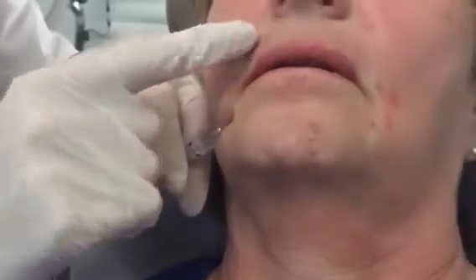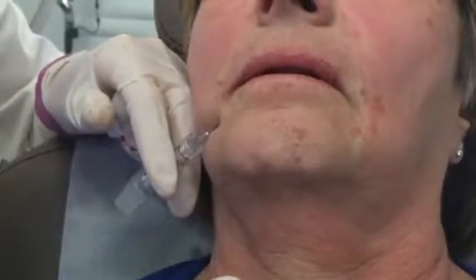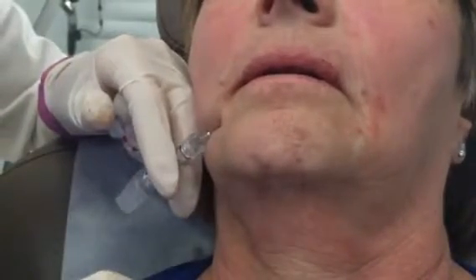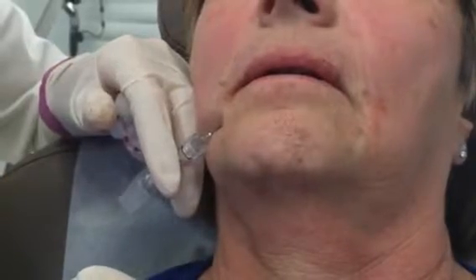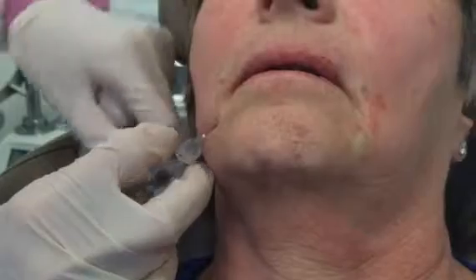You can see that I've done it on the upper lip and you can see how much smoother that area is. There isn't a tremendous amount of swelling, and what we'll do is just finish up and mirror the lower lip with what we've done in the upper lip. So with that, I'm going to do a little bit of the cannula work.